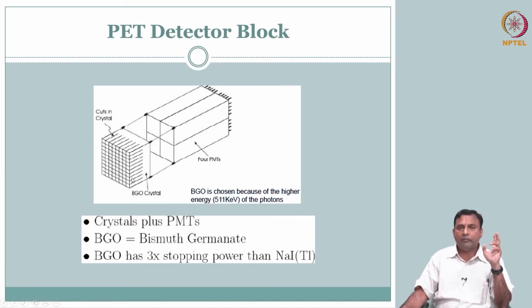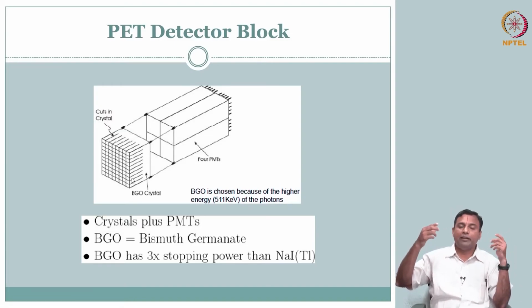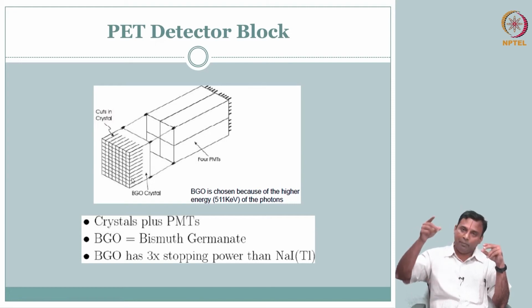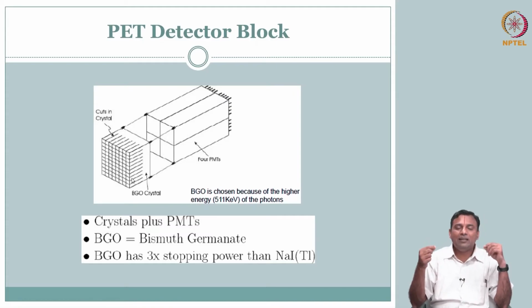And the idea is, if I want 2 crystals to detect, intuitively we might think, why don't we have small detectors, many of them, so that we can better localize. But then the challenge is, the smaller the detector, we saw about the pixel signal to noise ratio in nuclear medicine, that will become a problem. So in order to avoid that, PET takes the advantage of both.